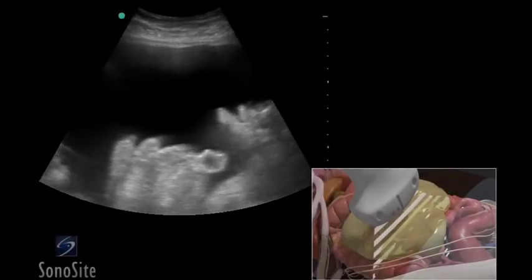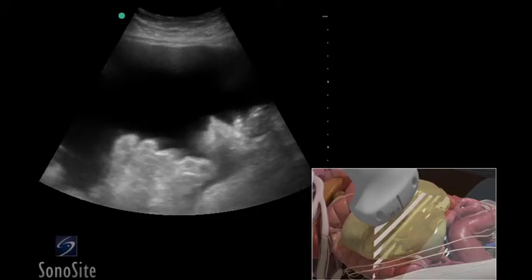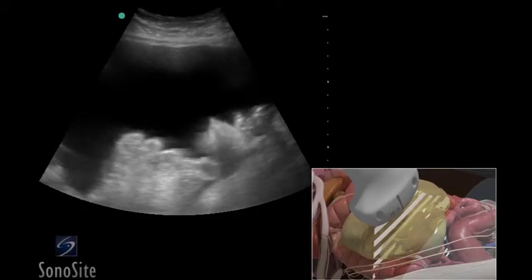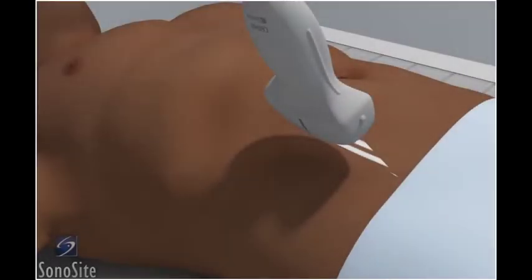A curved array transducer with an abdomen exam type is used to perform an ultrasound-guided paracentesis. It is easier to perform this exam when the bladder is not filled. The patient is placed in a supine position.